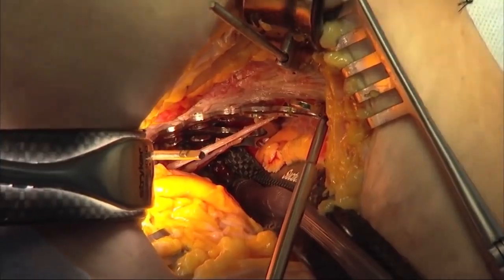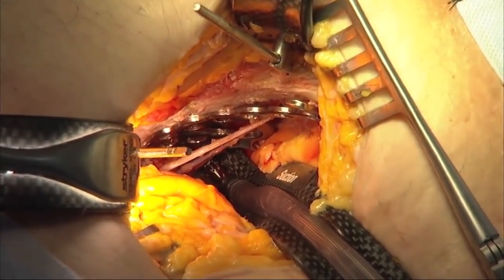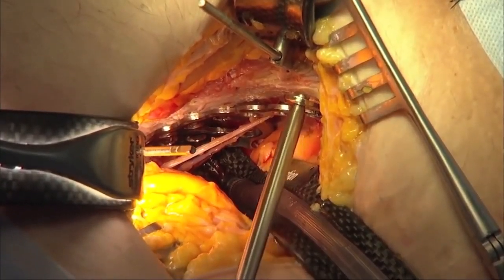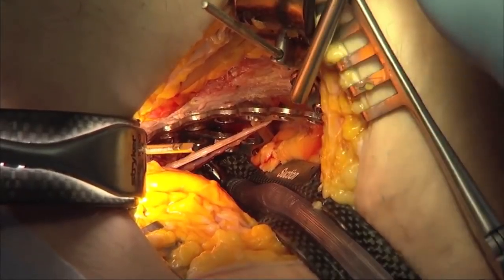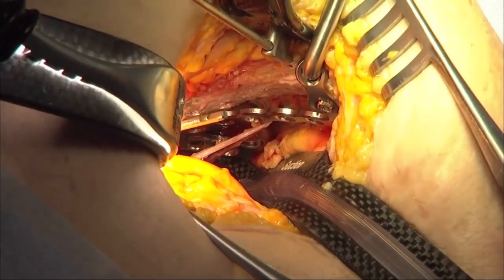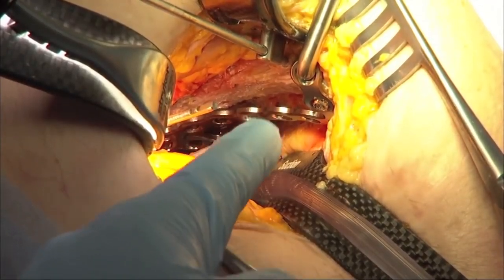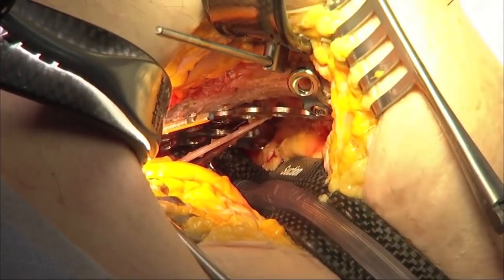So once the plate is down nicely to the bone at the fulcrum, we take the in situ bending iron and then using it like a joystick, we can bend and contour the plate right over the pubic body and the superior pubic ramus. The bending iron has two different ends, one end having a bend to it and the other end being straight, depending on what part of the pelvis and the anatomy you're in and how much bend you want to get.